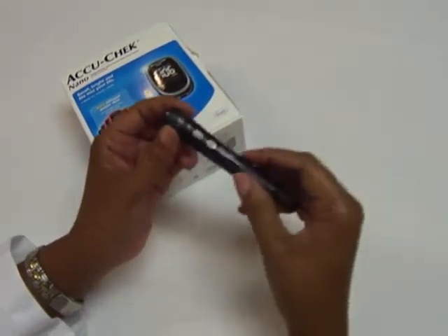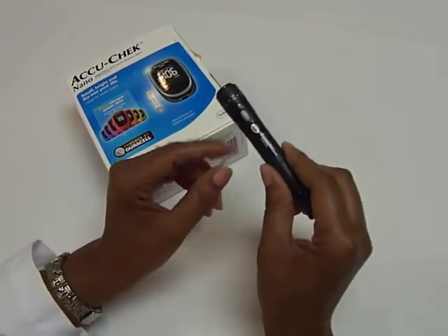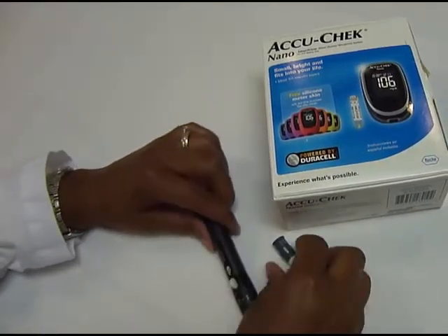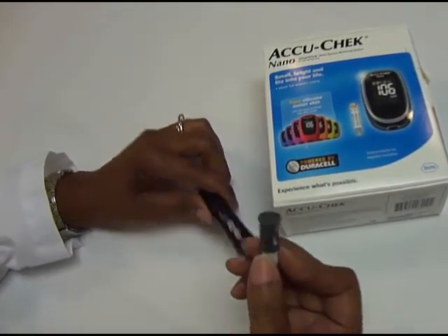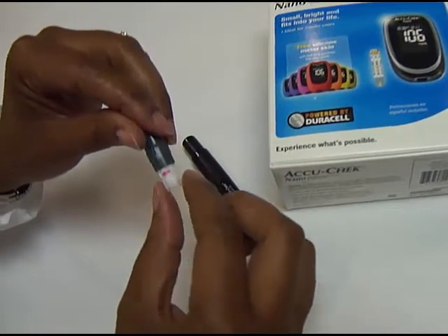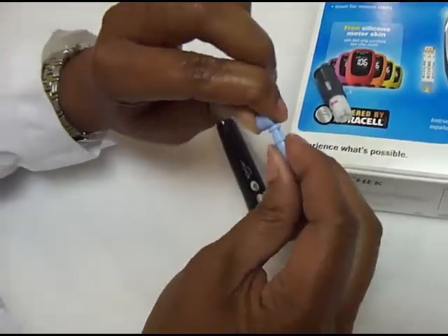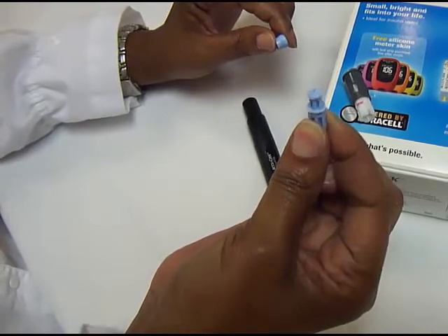Once I've done my finger stick, I need to reload my lancet device. So I'll click over and back, and my number changes. Now I have 5 lancets in this drum. This drum had 6 lancets in it. Once it's done and you take it out of your lancet device, you'll get this pink strip. This is the only lancet that can go directly in the trash. All other lancets are made for other meters and have to go into a sharps container or a closed container.